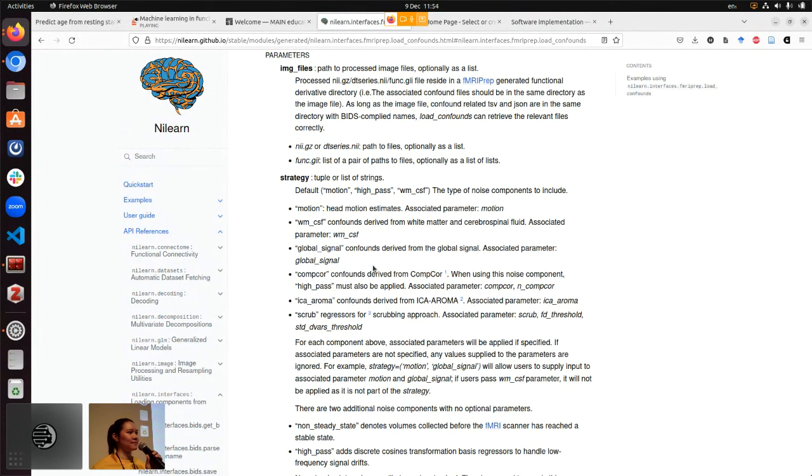Are they included with the data, or are they computed? Okay, so the other question is whether the confounds are included in your data, or are they computed separately? If you mean, is it in the signal, then yes, they are mixed together. No, I mean when you look at the data set, is that a separate part of the data set that has been pre-computed and you just load it, or do you compute it on the fly when you load it?